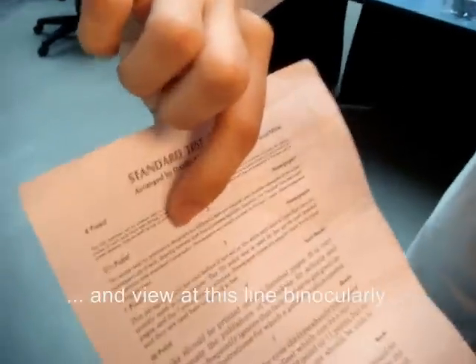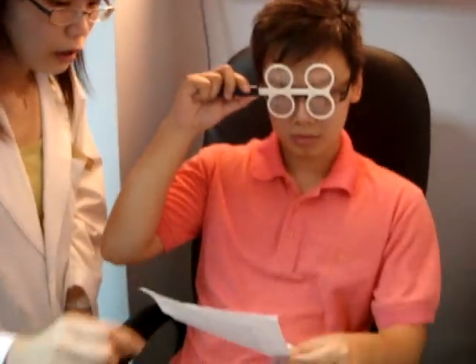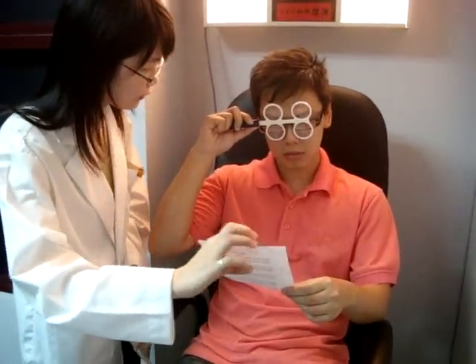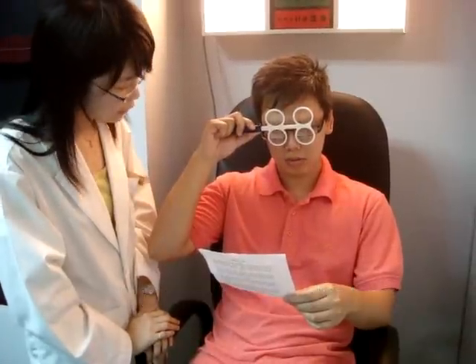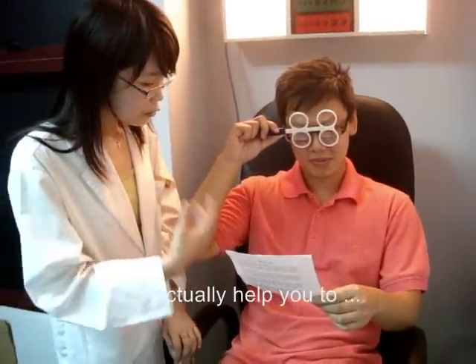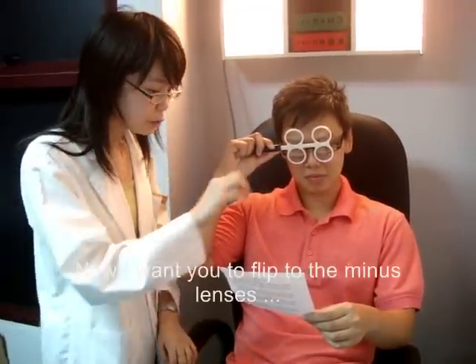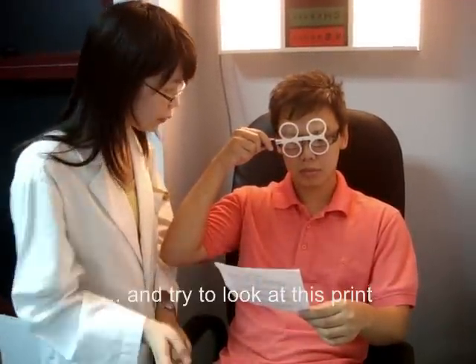View through this line binocularly with the plus lenses first. I want you to try your best to clear the print. Is it clear? How did you feel with the plus lenses? This actually helps you to relax your accommodation, just like you are looking far. Now I want you to flip the lens to the minus one and then try to look at this print.